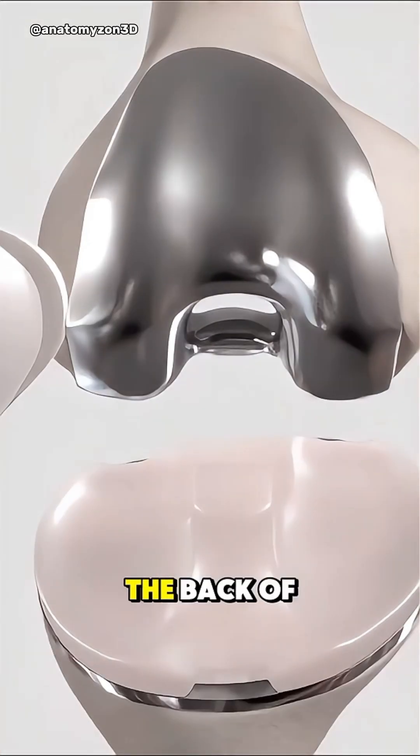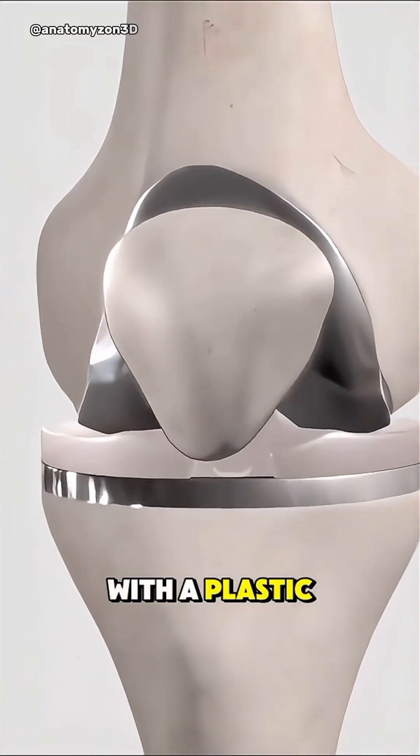If needed, the back of the kneecap is also resurfaced with a plastic button.